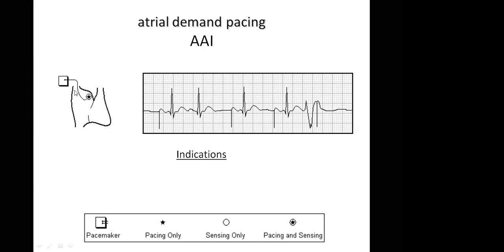So you put the patient on just an atrial lead. So you do that in sick sinus syndrome. Okay? But always remember that for a patient who has developed sick sinus syndrome, it is just a matter of time. He will soon develop AV node dysfunction also. Because it's a degenerative process. So the same thing that has taken off the SA node will soon take off the AV node.